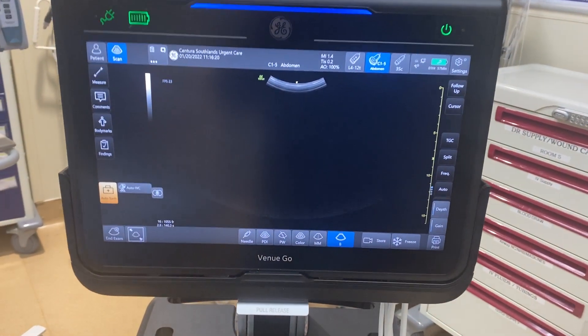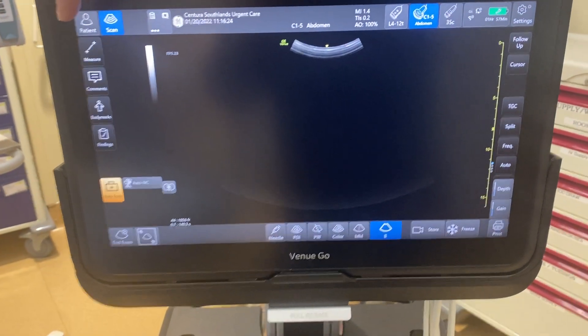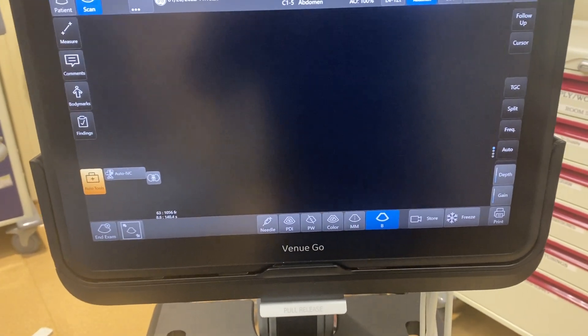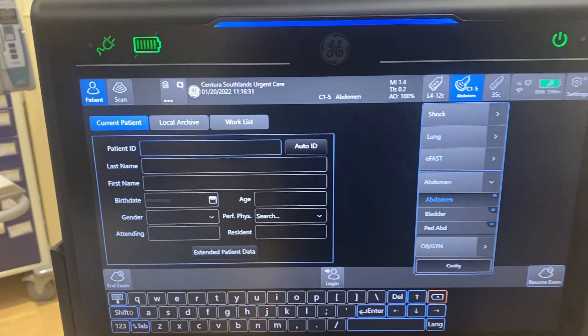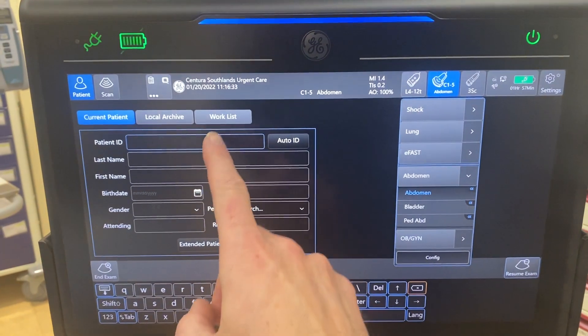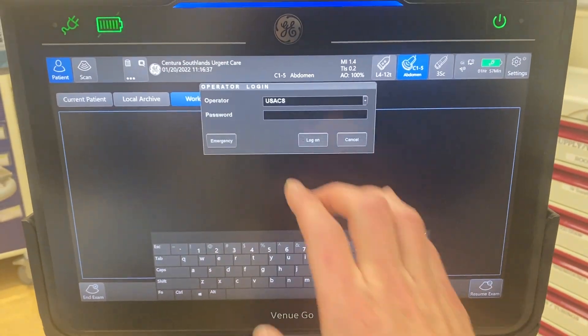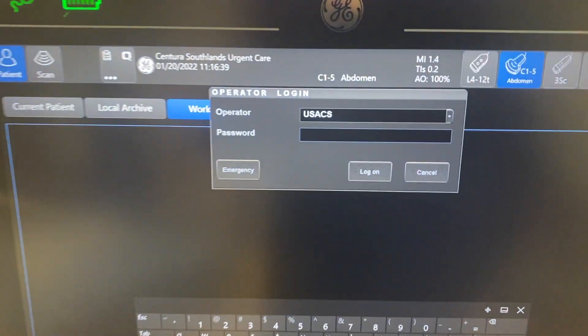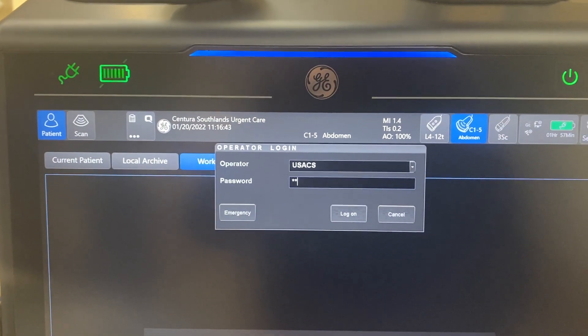The first screen that comes up is gonna be your basic screen. If you go to a patient up in the top left corner and go to worklist, just like we normally would on our other machines, it's gonna access the worklist. It's gonna ask you to log in the first time in the day. The username and password is gonna be the same as it has been everywhere else — it's USACS and then Denver.